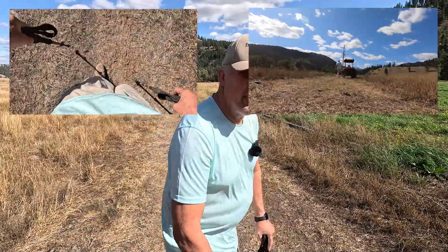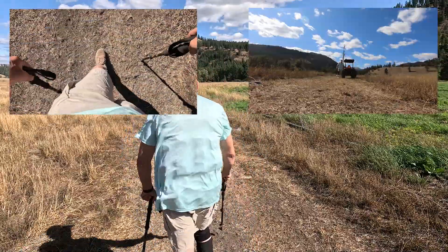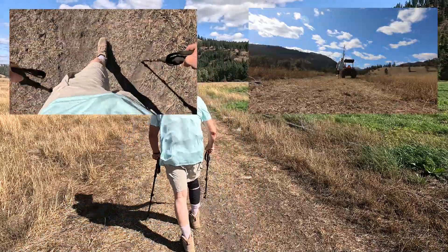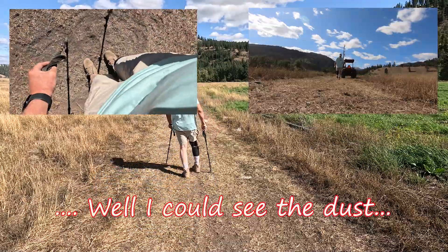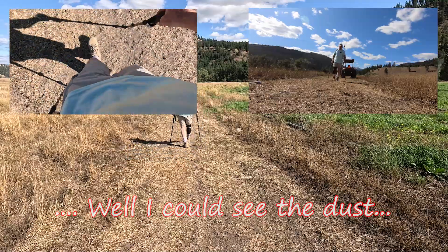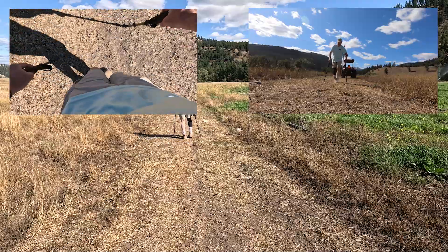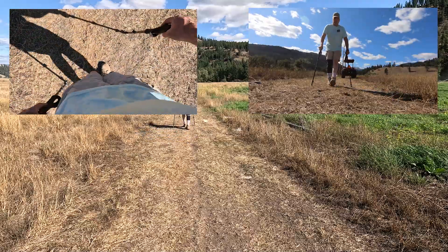Let's do another pass here. Sorry about the wind, not much I can do about that. But you can see the dust I'm bringing up. Yellow jackets don't like it either — they're down on the ground. Yeah, my stride's a lot shorter.